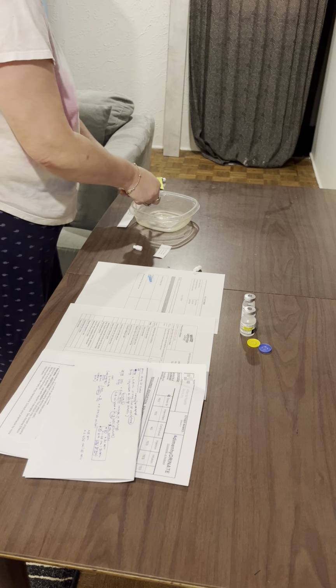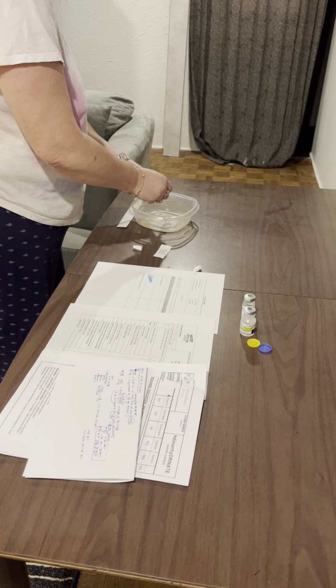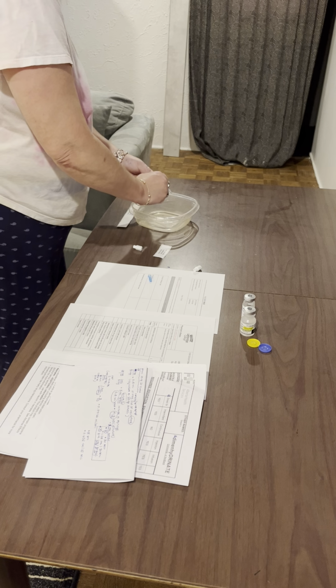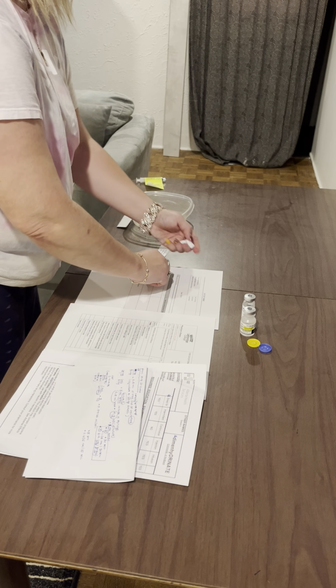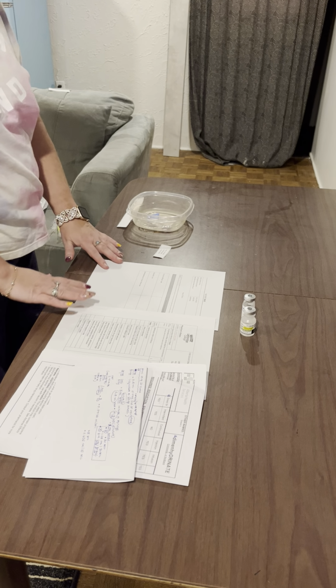Okay. So once all of the medication is through, we can disconnect the flush. Again, maintaining sterility, we can re-lock the saline lock here. Okay, great. And obviously we get rid of everything in the sharps or the garbage. And that would be it for the medication administration.